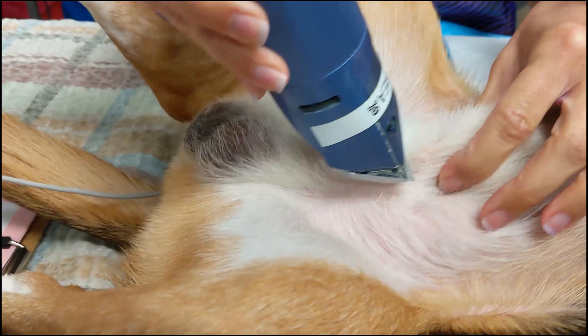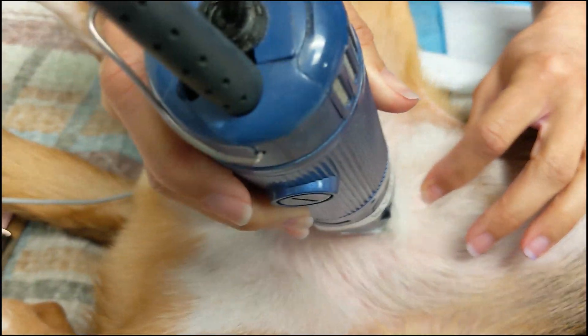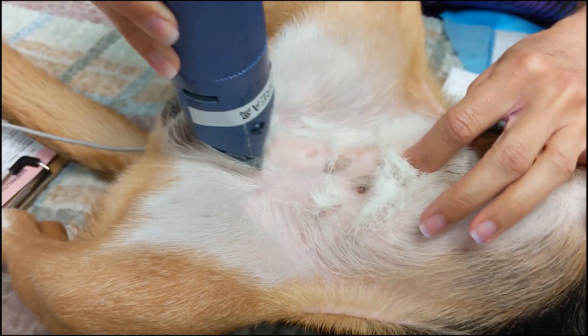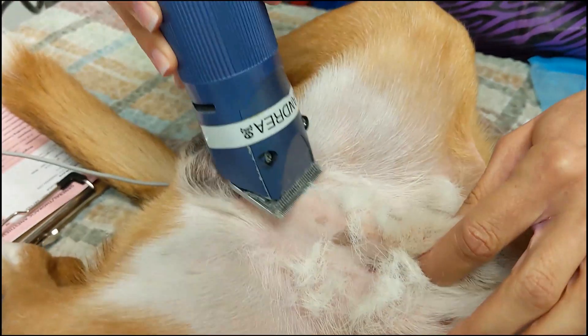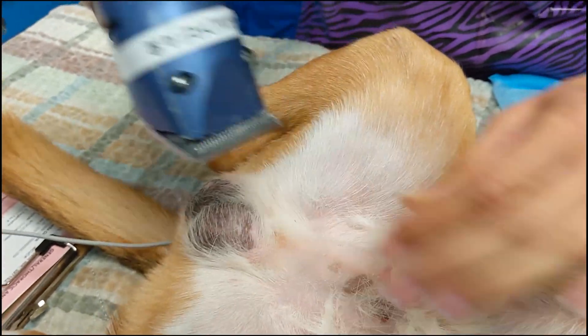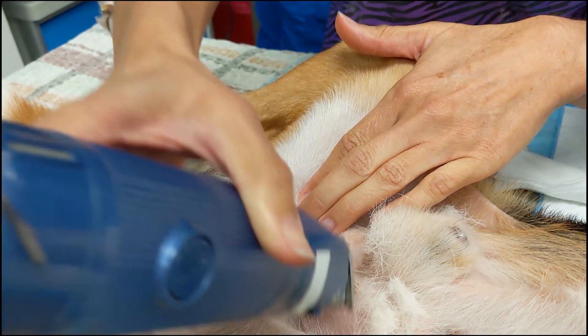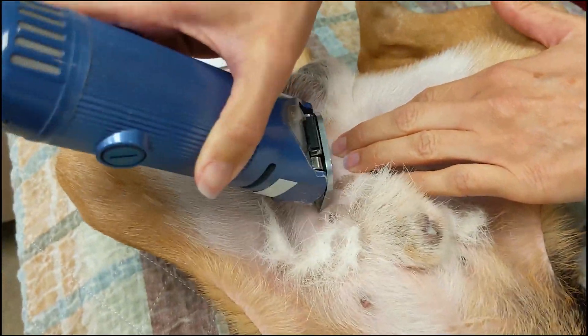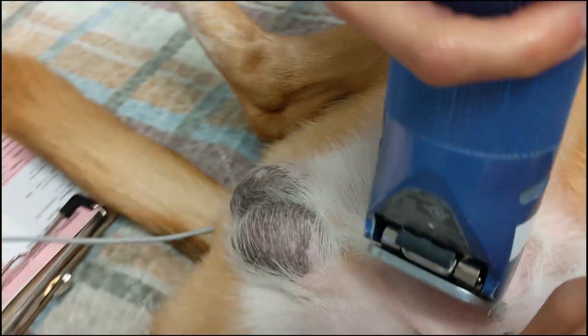The skin is clipped on midline from the cranial half of the scrotum to about mid prepuce, and then about five centimeters laterally on either side. The hair is first clipped in the same direction as the fur growth, and then in the opposite direction once it is shorter and more manageable. Avoid clipping the scrotal skin itself too short, as the skin is very easily irritated and this can lead to post-operative self-mutilation.